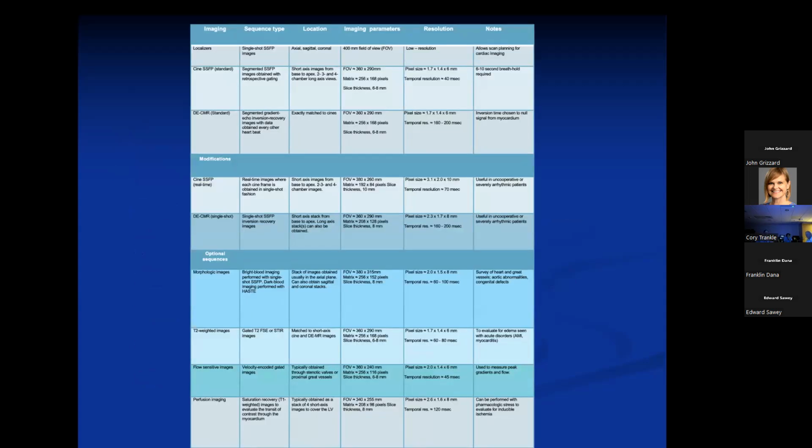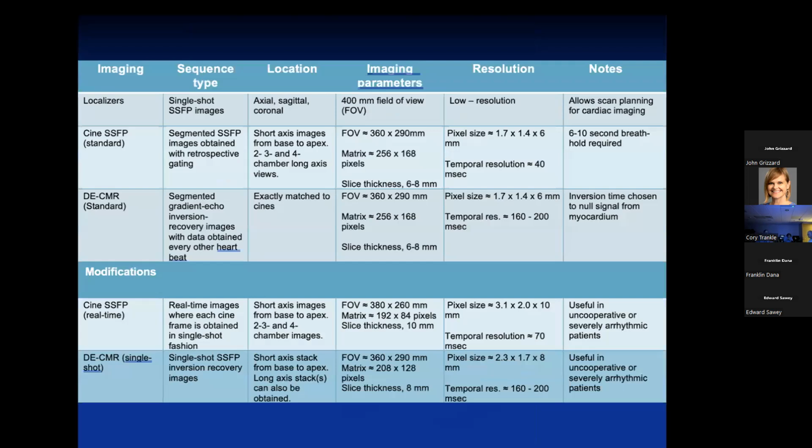And this is probably incapable of being read on a screen as it is. But I put it in here because it might be possible, if you can download this talk or review it or whatever, to be able to see. And then I actually did some where it's a little bit more readily readable.